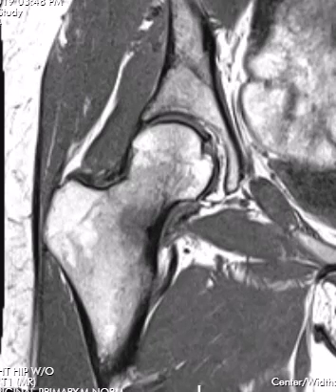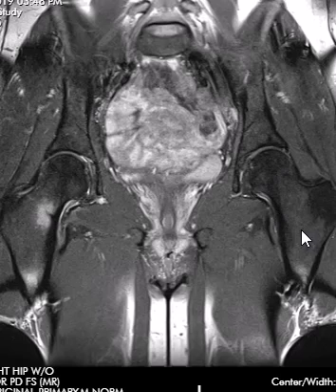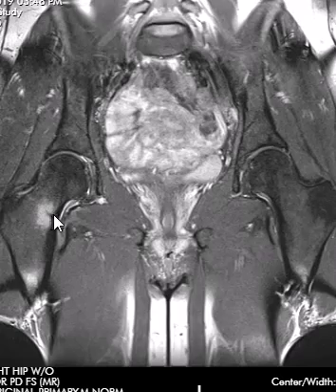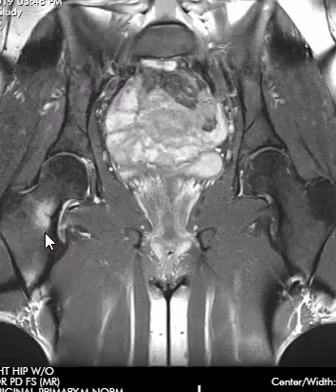If I put up another view here, we'll see this a little bit better. This is a fat-suppressed proton density sequence. We can see the left side here looking nice — normal, uniform low signal — and here we see that stress fracture. You can see a little horizontal transverse component, a little halo of marrow edema, and again this is just a classic location.